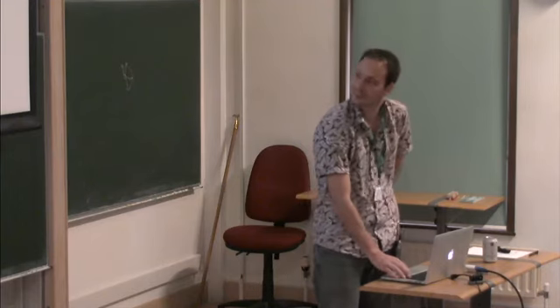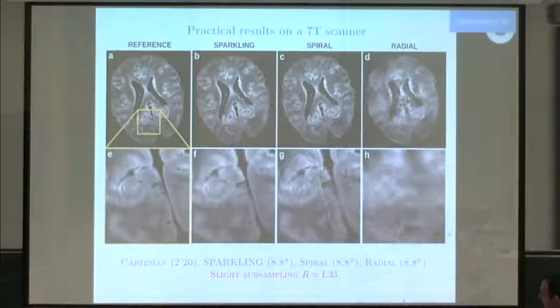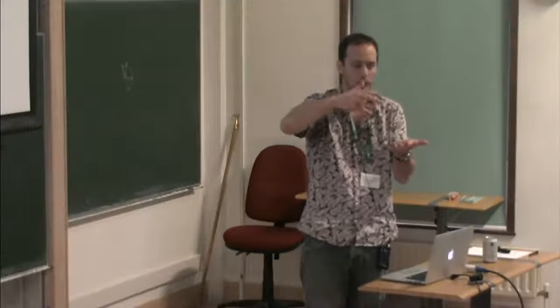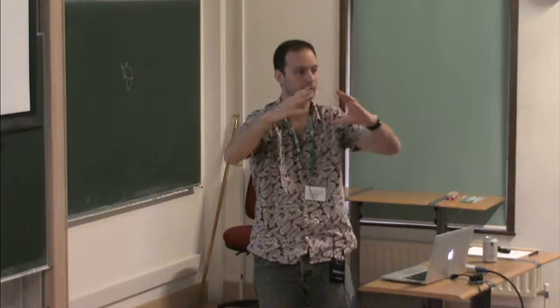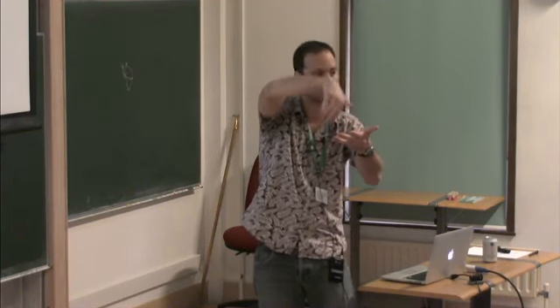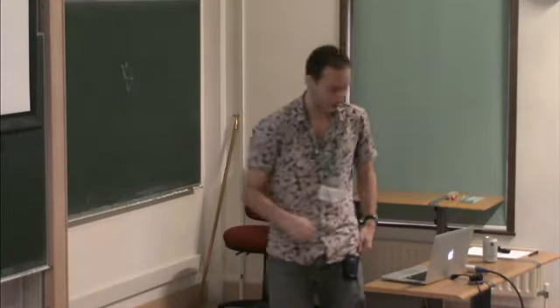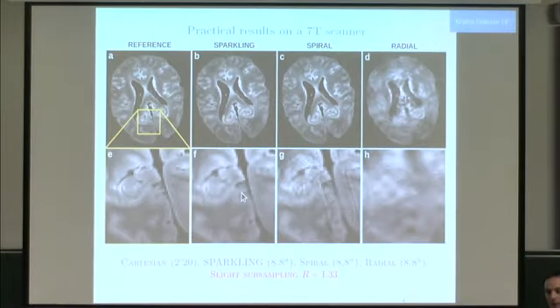Yes, so I think this is related to this figure where you see that the spiral is generating many artifacts here. The reason is that, for instance, for the epsilon of t here, the perturbation that you have, one model that you can have is a linear time invariant model. So instead of observing your spiral, you observe a convolved version of it. And so it means that all your samples will be shrunk towards the origin, and so the perturbation will be highly correlated. In our case, we have plenty of circumvolutions, and so the jittering errors will be basically arbitrary, and this is why we get better. We don't get these artifacts here. That's thanks to the many circumvolutions of the scheme.